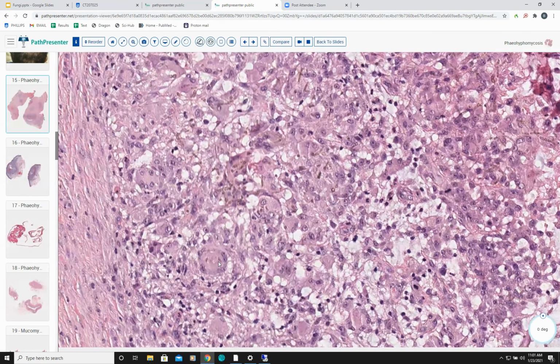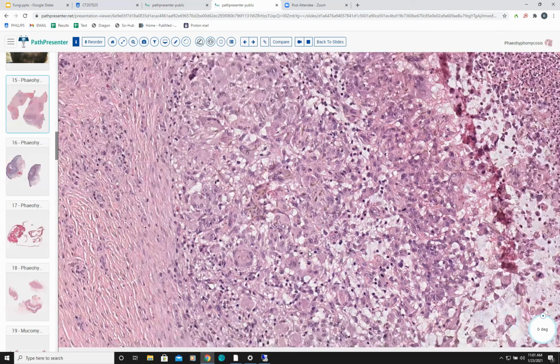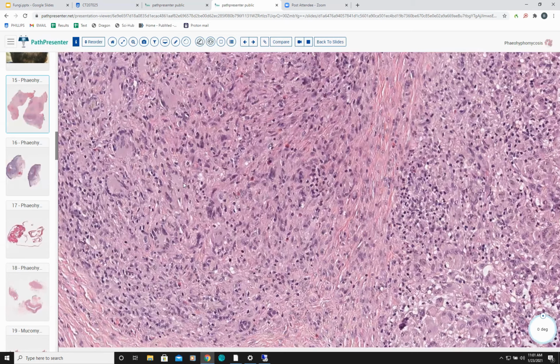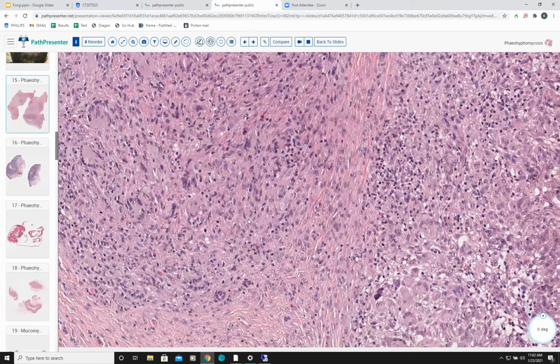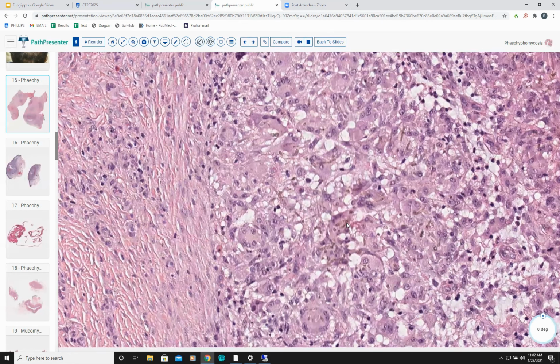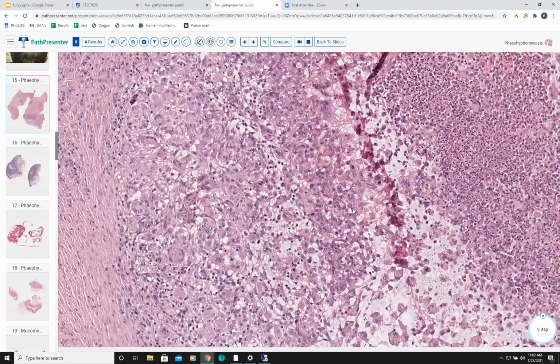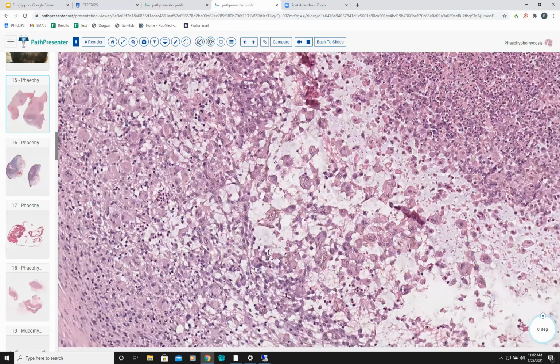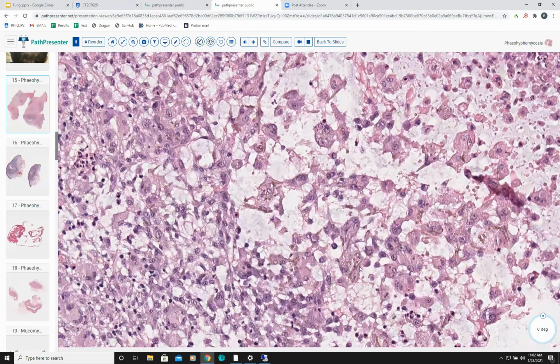Here you can see in the giant cell some fungi, and this is a relatively easy diagnosis to make if you have this many organisms. If you don't, you can always do a PASD and a melanin stain, a Fontana-Masson stain, to show that these are pigmented. This one had quite a lot of organisms here, you can see.